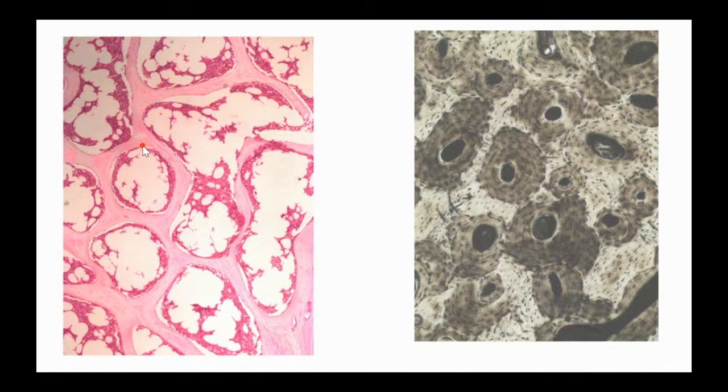So you can get clues from a lot of the names of the cells that we're learning. They tell us what they look like, what they do, all that kind of stuff. Absolutely. So osteocytes in bone tissue, chondrocytes in cartilage tissue. And fibroblasts, we're going to find those in all those tissues that have a bunch of fibers. So areolar connective tissue, dense regular connective tissue. We can't really see them in dense irregular connective tissue, but they are also there as well. Anyone that's got a bunch of fibers, we're going to have some fibroblasts there too. Yeah, great connections to make.